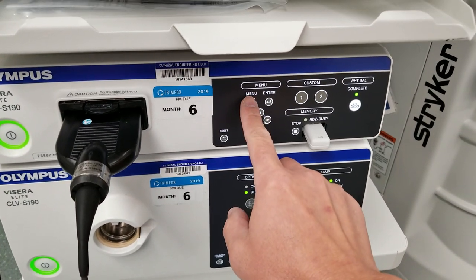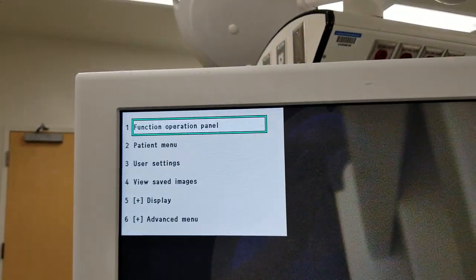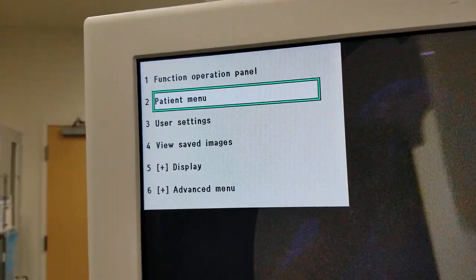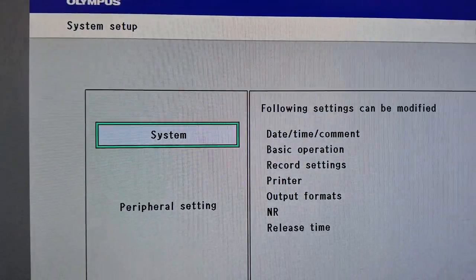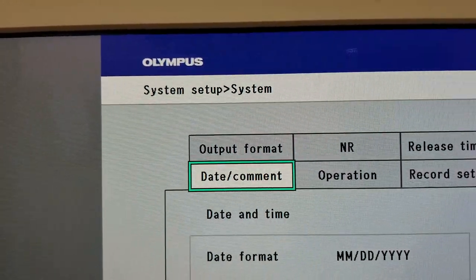If you go down here, press the menu and you will see this on top. Go down to Advanced Menu, hit Enter, go to System Setup, hit Enter, then System, hit Enter, and go up to Output Format.